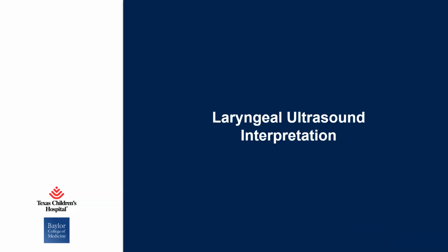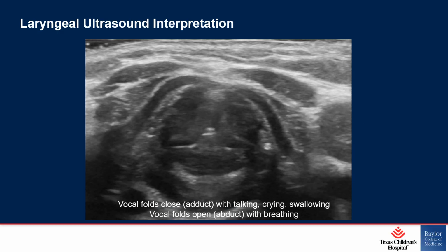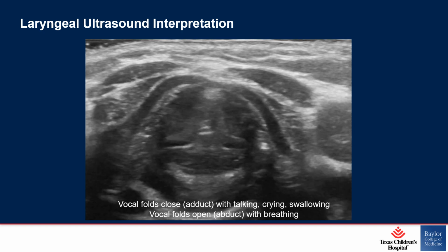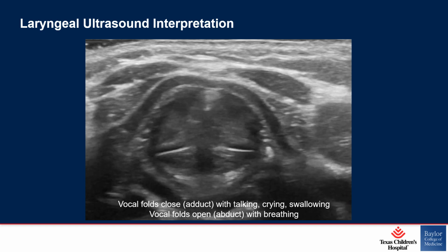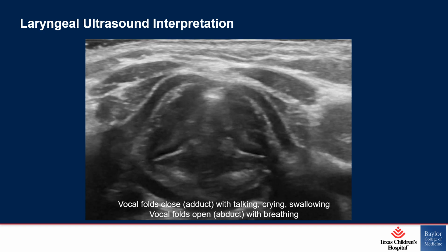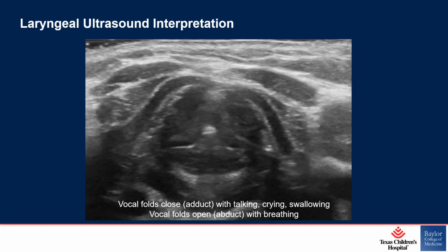Part 2, Interpreting the Laryngeal Ultrasound. So this is what a laryngeal ultrasound looks like. When we breathe, the vocal folds open or abduct, and when we talk, cry, or swallow, the vocal folds close or adduct.